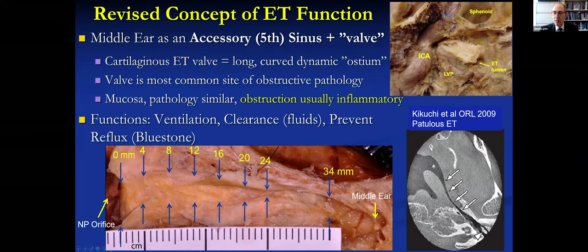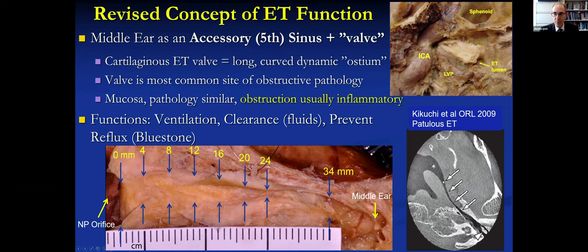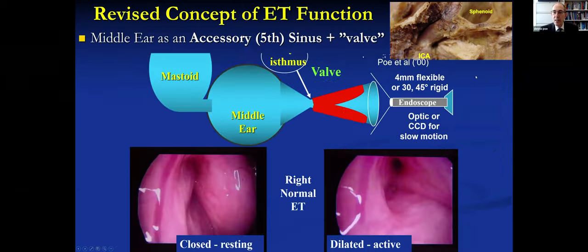Keep in mind two important points: the eustachian tube is not straight — it's actually quite curved. You can see where this air contrast shows a patulous eustachian tube curves significantly medially and then turns laterally toward the temporal bone. In a normal patient who's not patulous, the torus is going to be thicker here, which accentuates that curvature. Also, the higher we get toward the temporal bone, the closer we're getting to the internal carotid artery — so we'll keep those things in mind as surgeons.